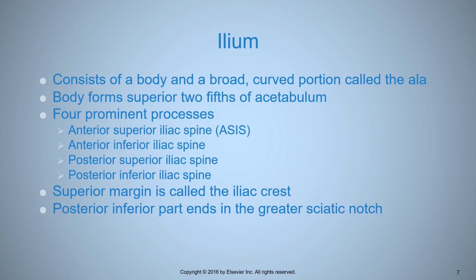So if you're digging and mashing, but you're on top of the patient's belly, that hard bump that you feel, that's the ASIS. You have to dig into their side, or closer to their spine, to palpate the iliac crest. You almost have to reach underneath the patient and palpate at their flank to palpate the iliac crest. So that's how you keep them straight and don't get confused. Palpating the ASIS is on top of the patient when they're lying supine.